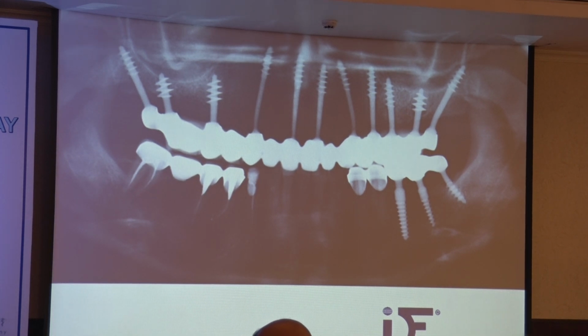Well, this patient required full upper jaw reconstruction, and as you see in the lower jaw, the first molar was missing on the left side, so it was absolutely necessary to do also something in the lower jaw. I mean, the alternative would have been that we equip the upper jaw with teeth from 5 to 5, but this is of course not a good idea if you do the upper jaw new.